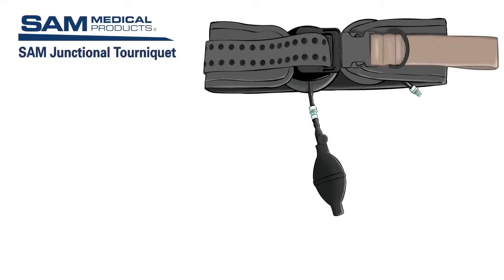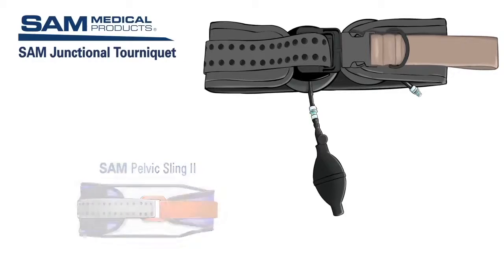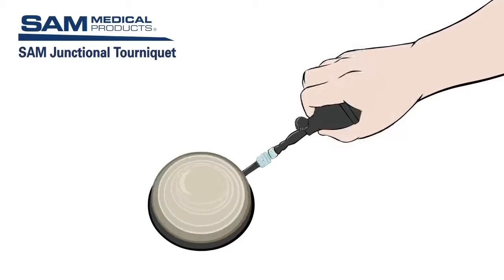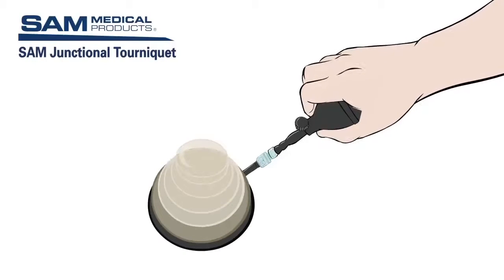Training time needed prior to field use of the SJT is minimized because many components are already familiar to medics, such as the hand pump, commonly used to inflate blood pressure cuffs, and the belt, which is a modified SAM pelvic sling. The TCD is the mechanism that, when inflated, provides pressure to occlude blood flow and control hemorrhage.